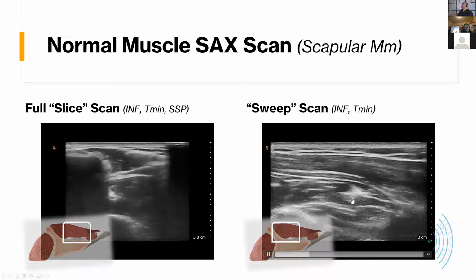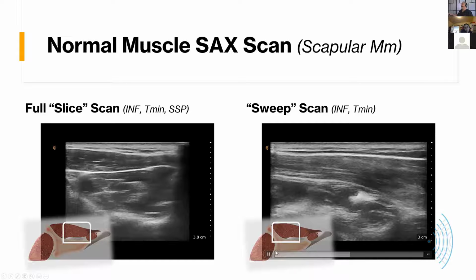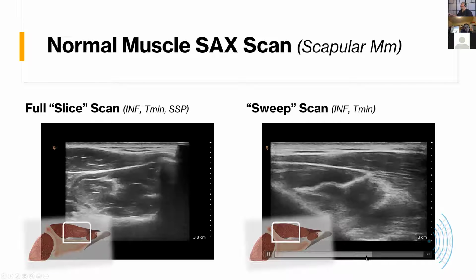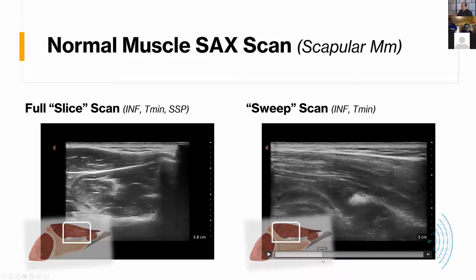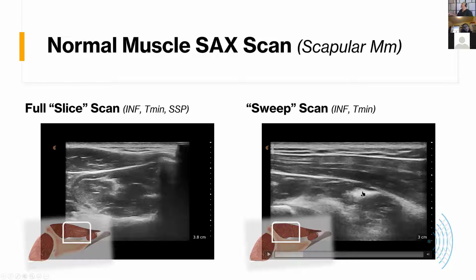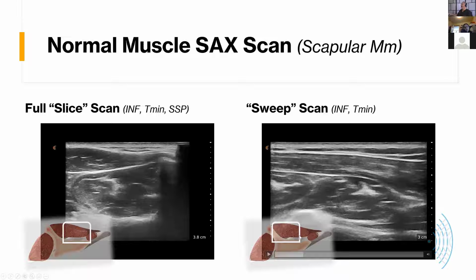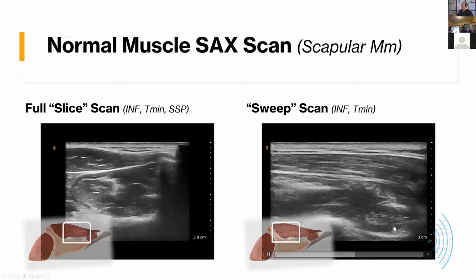We're sliding toward the humerus, and you can see what started out to be the fibroadipose structure. Let me go back to the teres minor. So what we started out to have as the intramuscular aponeurosis begins to come down all the way to a tendon where it inserts onto the inferior facet.